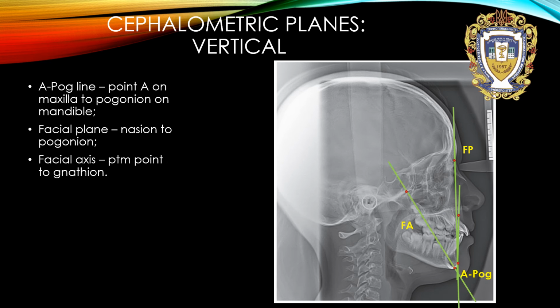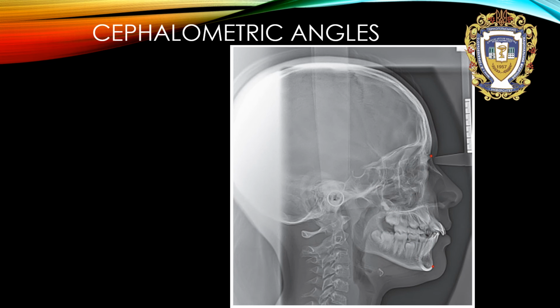And facial axis, PTM point to gnathion point. And as a result of marking our landmarks and planes, a measurement of different facial angles.